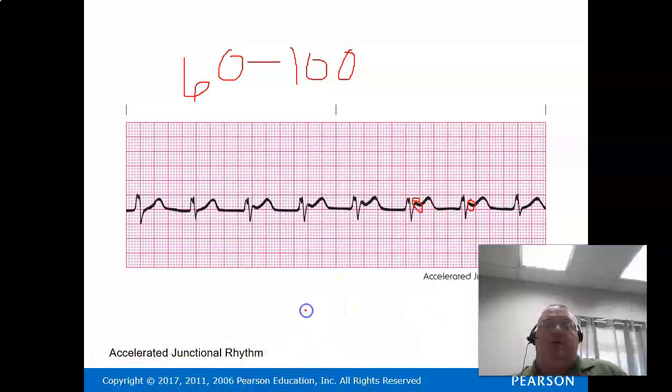I would say that we actually have probably the P wave maybe is actually coming in right back here. Notice there is no real PR interval that I can see, but my rate is 60 to 100. I'm going to stress that again. 60 to 100 is accelerated junctional. Now, what we call it, technically they say, well, Scott, that would be junctional tachycardia. You're absolutely correct. It would be junctional tachycardia, but we got something else that we're going to call junctional tachycardia, which is this guy right here.